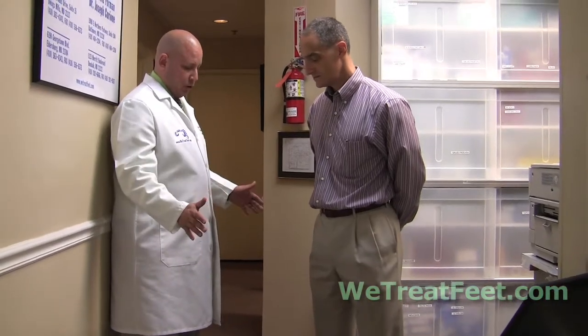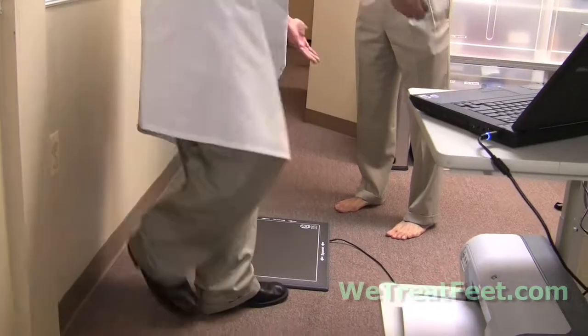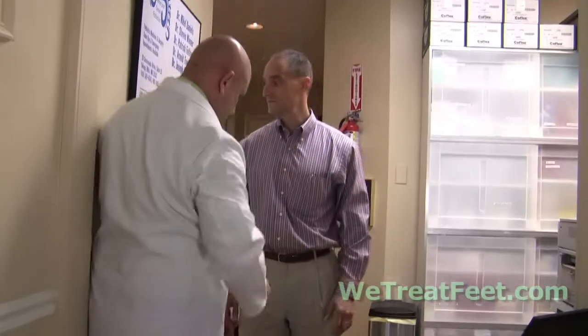What we're going to do here is we're going to take a look at how your feet are supporting your body weight both when you're standing as well as when you're walking. So there's two parts to this test. The first test, I'm going to have you come on to the mat. I'm going to have you turn and face towards the wall.